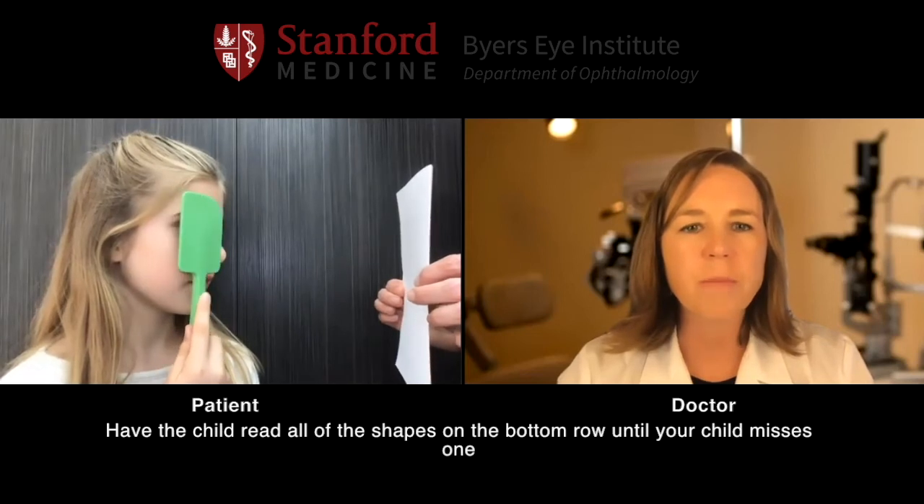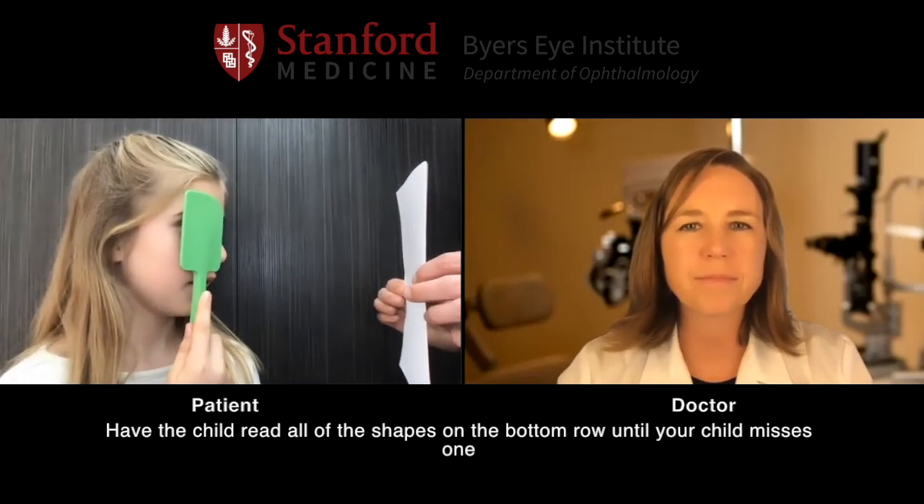And go ahead and start reading those letters on the bottom row for me. Circle, house, circle, house, circle, heart, square, circle.